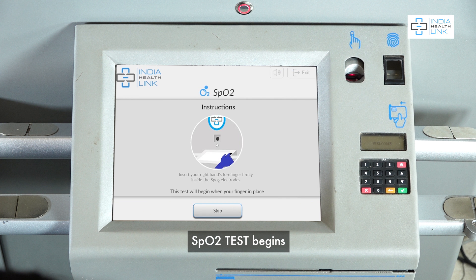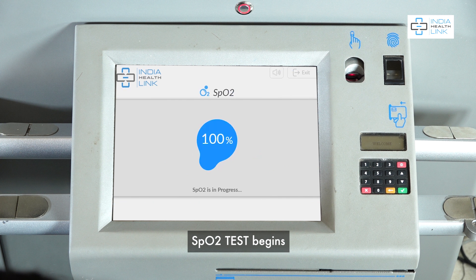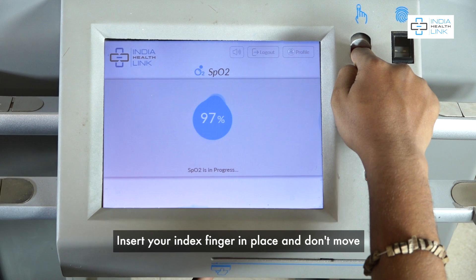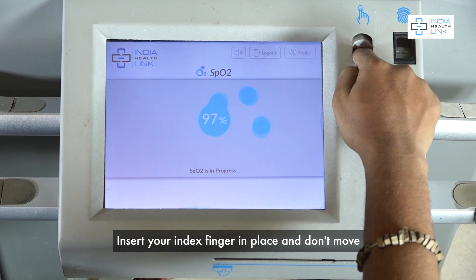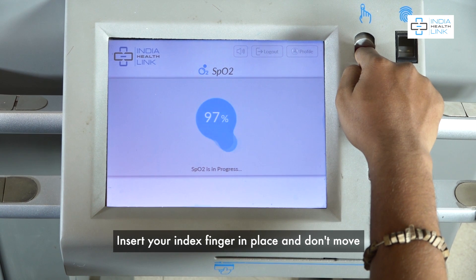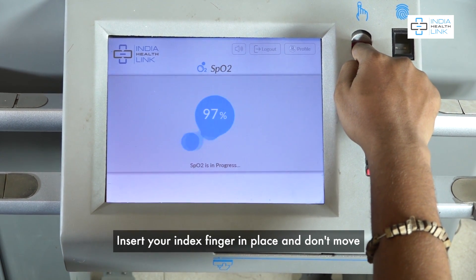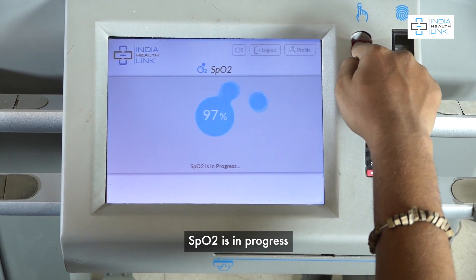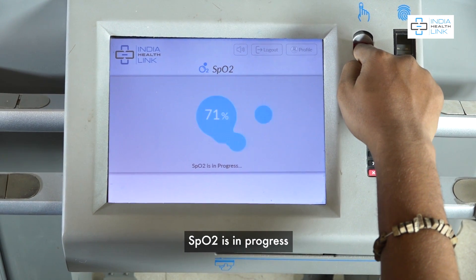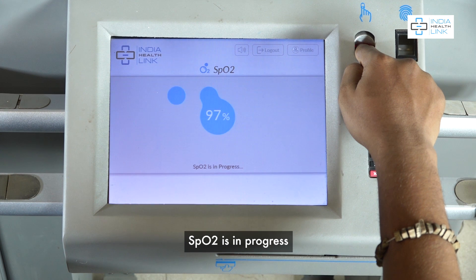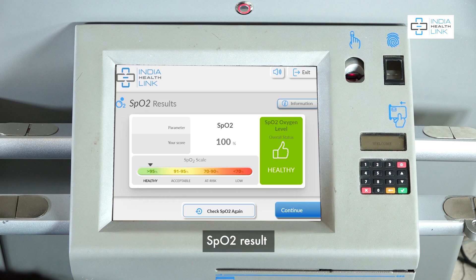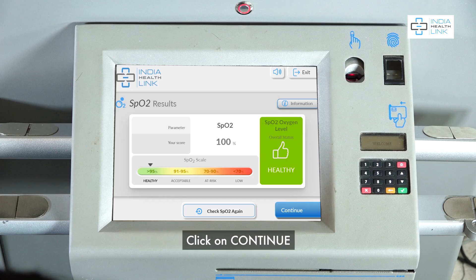SpO2 test begins. Insert your index finger in place and don't move. SpO2 is in progress. View SpO2 result and click on Continue.